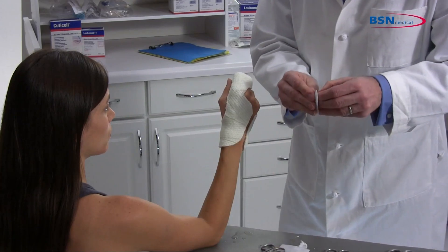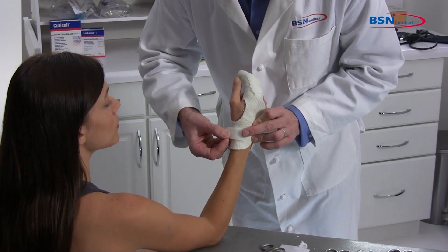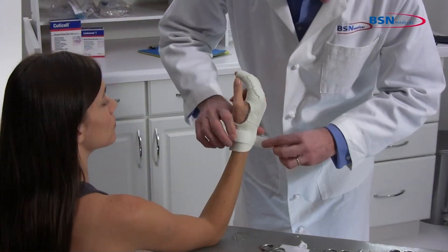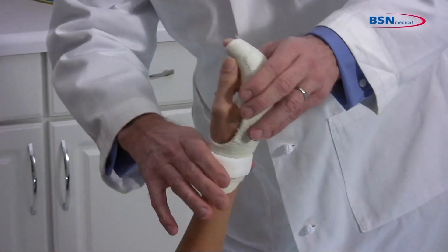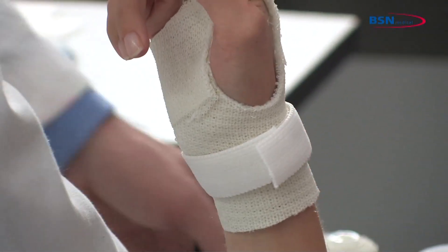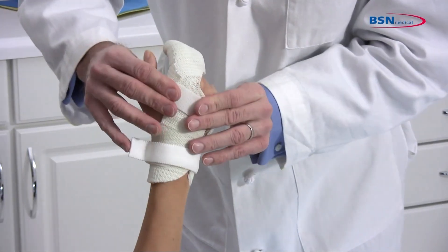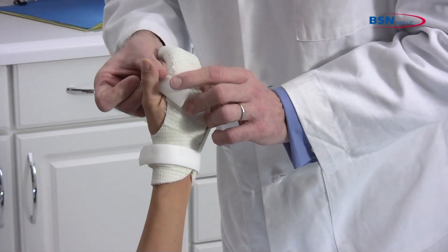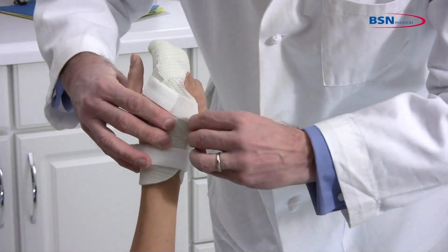Cut two small pieces of adhesive hook and place one over the medial wrist, then attach a stretch loop to close the cast. Attach a second adhesive hook on the dorsal hand and attach the stretch loop to close the cast.